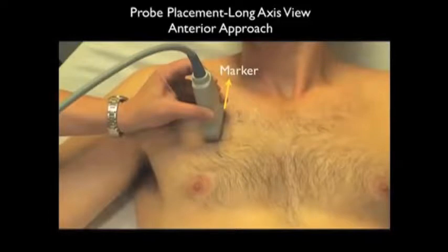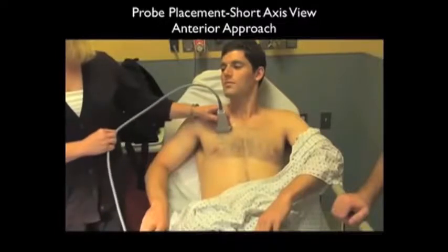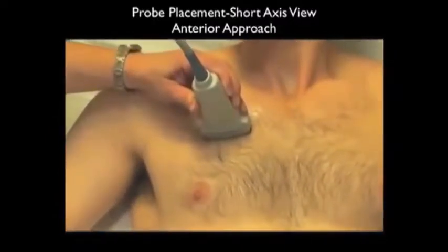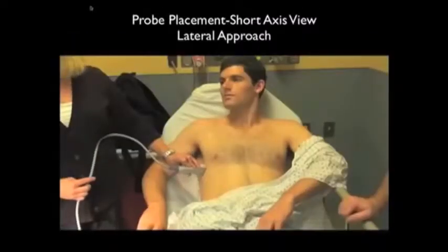Note we're looking at a long axis configuration between the ribs with a marker dot oriented superiorly towards the patient's head. Once we've identified both the ribs and the pleura, we can swivel the probe into the short axis configuration to further look at the pleura and to detect pneumothorax. Here we have the probe oriented in a transverse or short axis orientation between the ribs, looking directly down at the pleura. Notice in this case, the marker dot is located towards the lateral aspect of the patient. Using both long and short axis configurations will allow you to detect a pneumothorax with a high degree of accuracy.